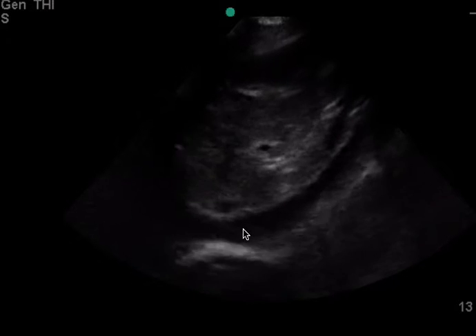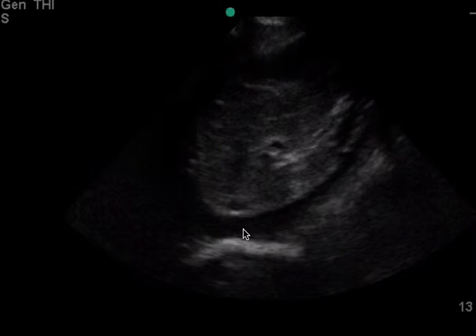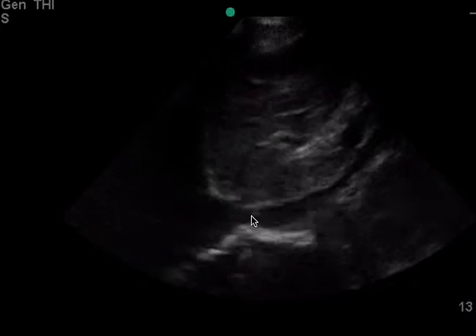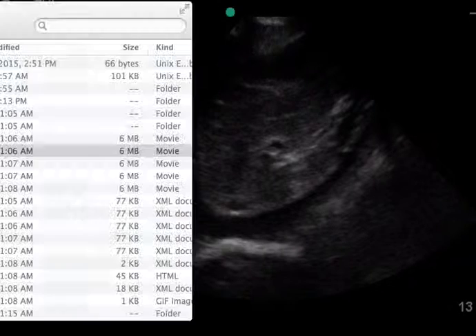With IVC ultrasound, you can really only use it at either extreme, whether the walls are touching, such as in the case the patient is volume depleted, where it completely collapses, versus the exact opposite, like heart failure, where it's completely plump. And in this case, it's someplace in between, so you can't make a clinical decision.